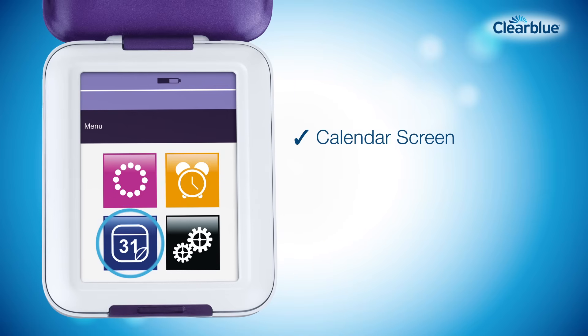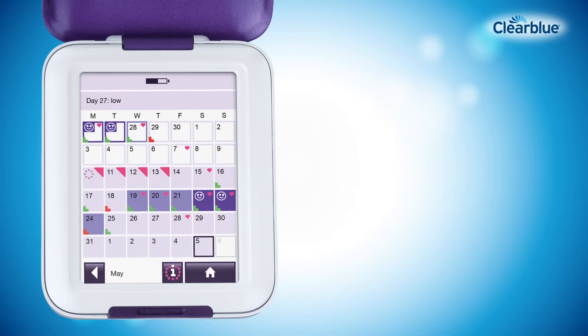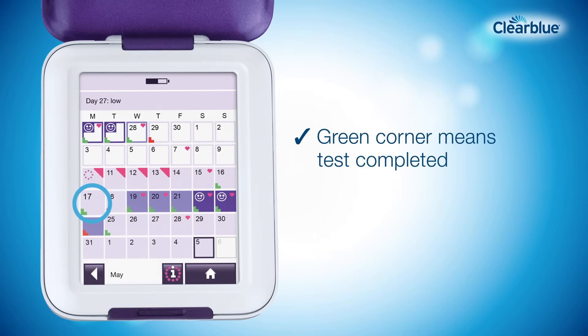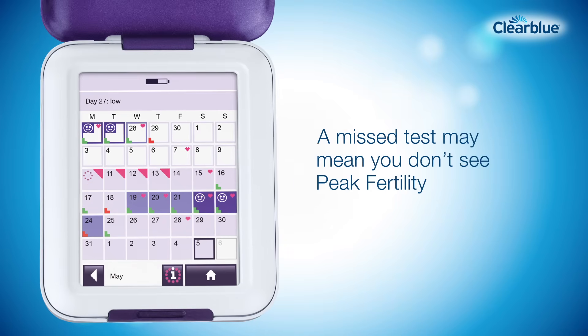Your calendar screen stores and displays information on your current and previous six cycles. If the monitor asked for a test, a green corner on that day of the cycle confirms you did a test as requested. If you missed a test for some reason, you'll see a red corner. If the missed test was close to ovulation, this may mean that you don't see peak fertility this cycle.